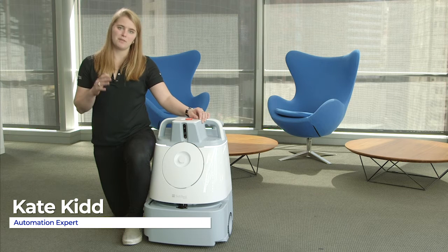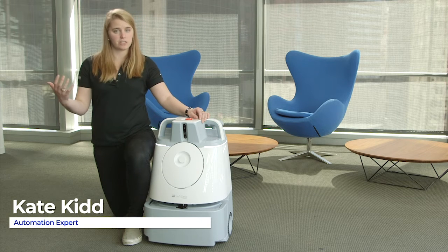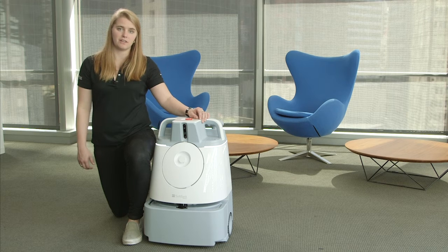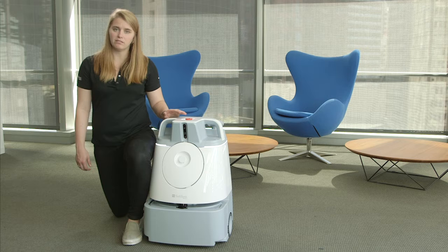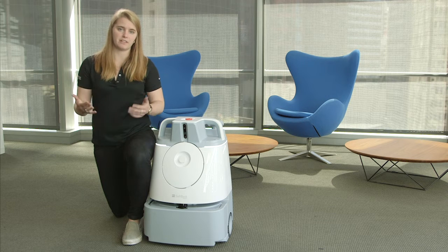Hi, my name is Kate. I'm now going to show you how to engage and disengage the emergency stop button on the unit. If the emergency button is out, the unit is able to run freely. That's disengaged.